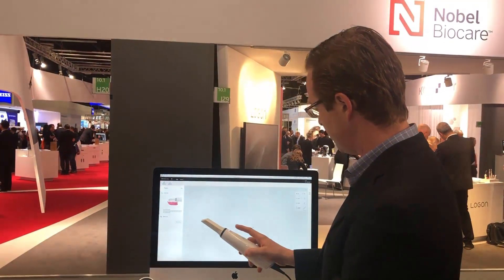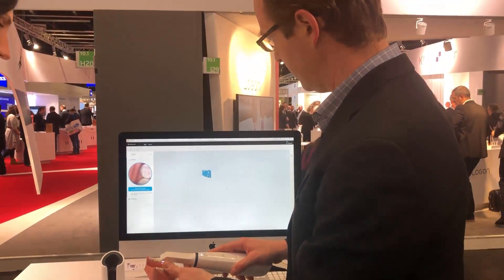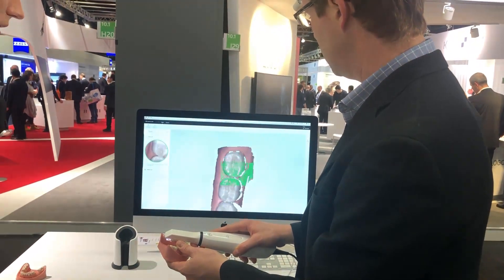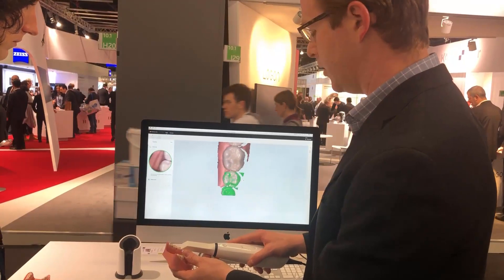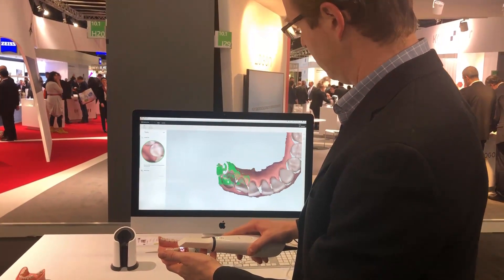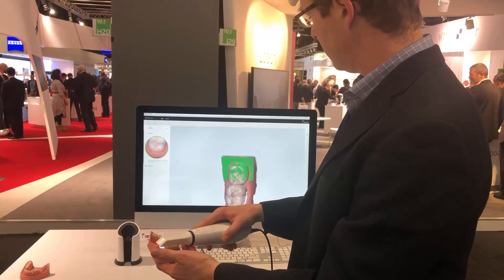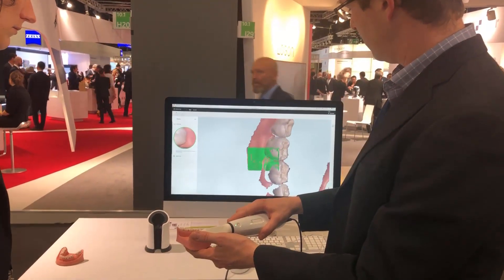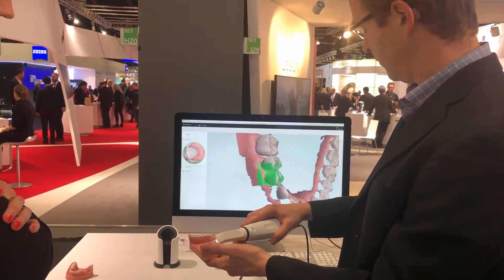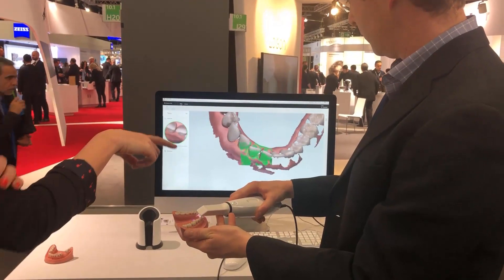Let's jump into a scan. It can scan with or without touch, and it can capture over a few millimeters. They advocate starting on the occlusal surface and going all the way across all the occlusion. I got the key out of the corner, then started over to the other side of the back.